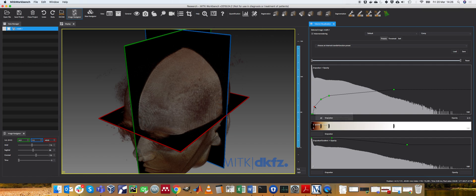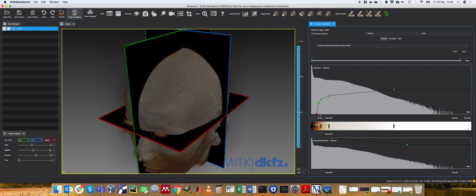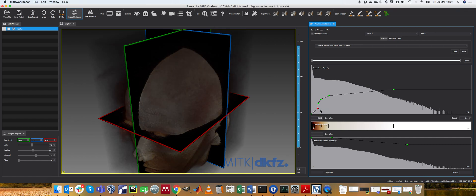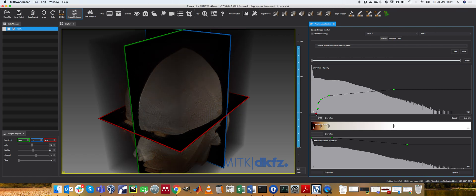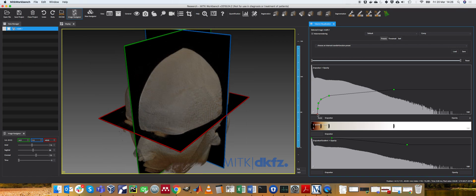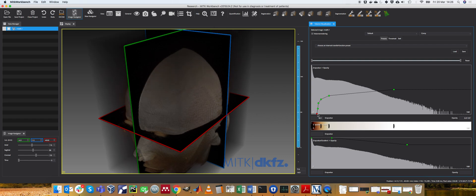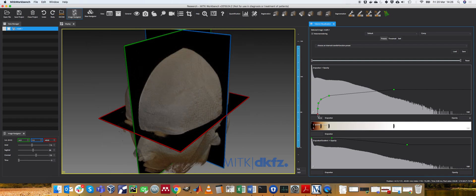So here we will see if we change this graph, firstly the rendering is changing in real time. So basically these parameters control the rendering directly, there is no segmentation necessary.